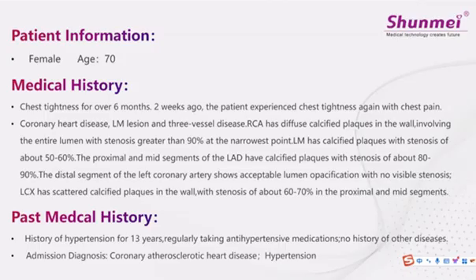For her admission diagnosis, she has coronary atherosclerotic heart disease and hypertension. So this is the patient information and medical history for our second patient, the Case2. And now our Dr. Yang will perform the coronary IVL procedure on our second patient.